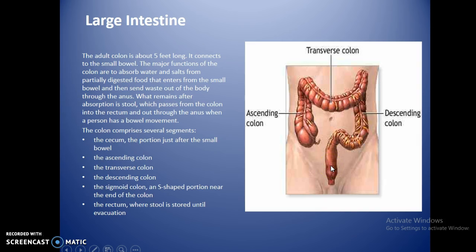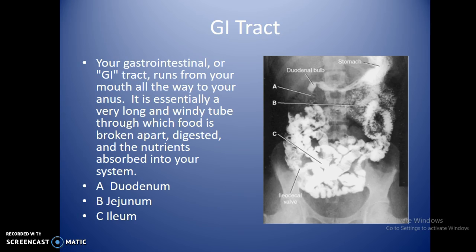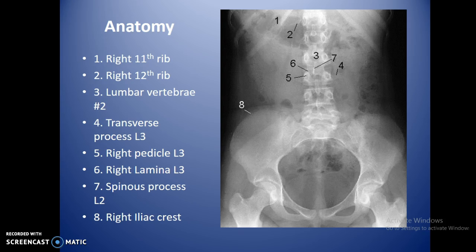GI tract just stands for gastrointestinal tract. We do quite a few studies with this, with the small bowel follow-throughs, as well as the BEs or barium enemas that we do. It's just showing some basic anatomy, which we will cover in class as well. But you should see the lowest point of the body should be the symphysis pubis, which is going to be this bony anatomy right down here, just below the bladder.